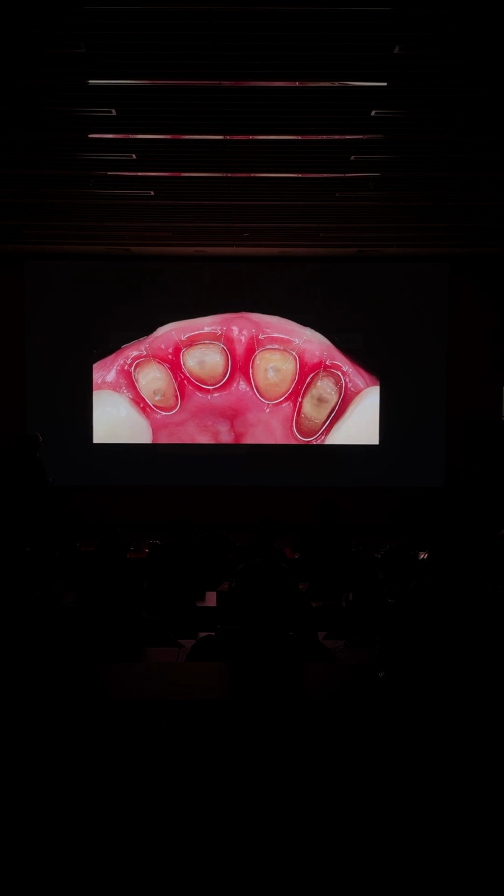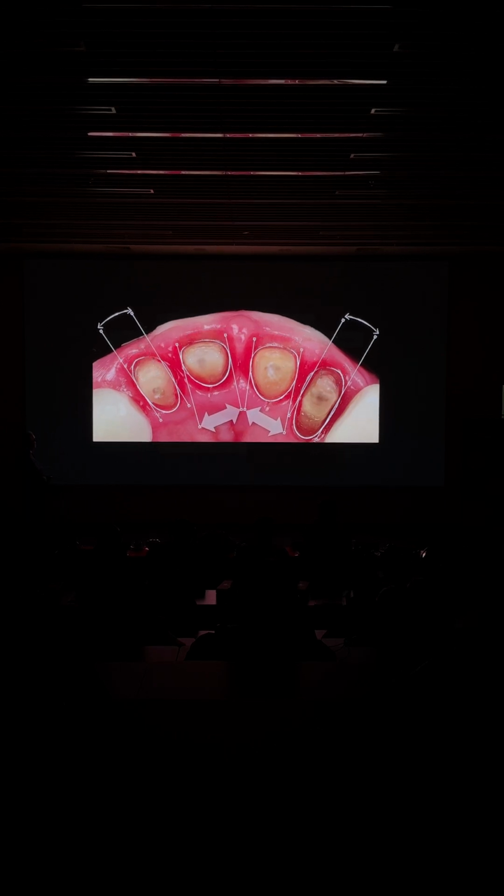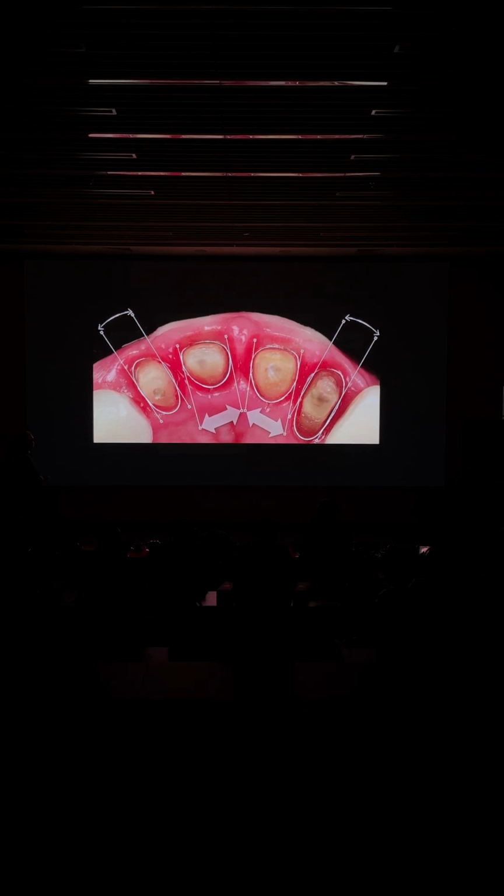And this is not easy to do. It's a lot of effort surgically and prosthetically, looking at roots that are totally different and that belong from other areas.